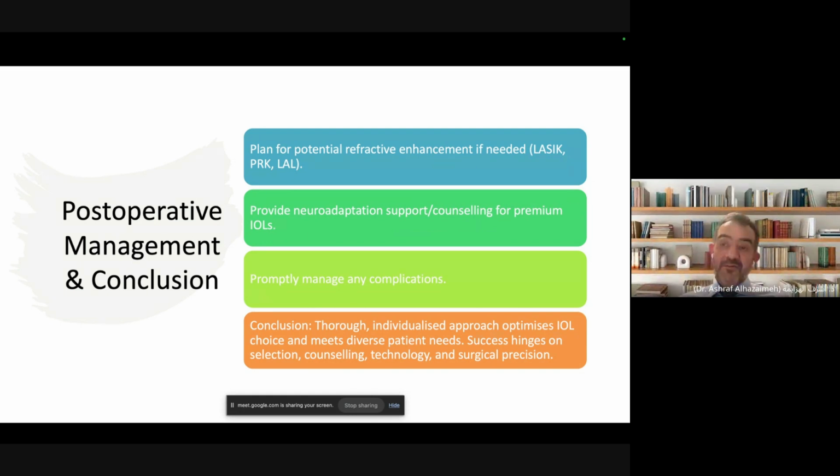One thing after implanting a multifocal or EDOF lens: if you have an unhappy patient, and you see the posterior capsule and decide that this discomfort or dissatisfaction is due to opacity in the posterior capsule, my advice is not to rush into doing a posterior YAG capsulotomy.